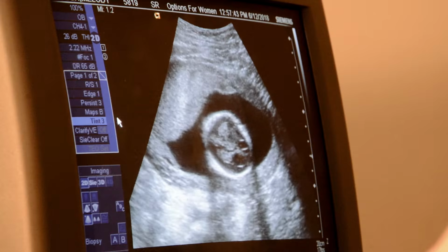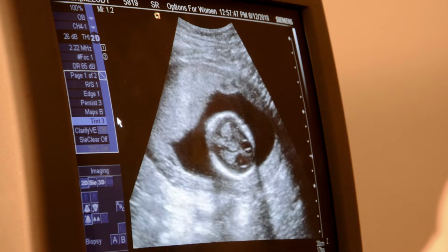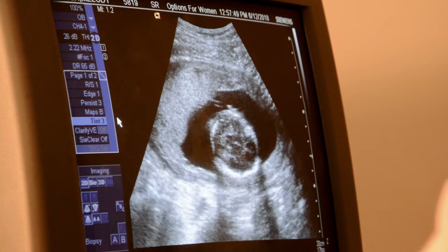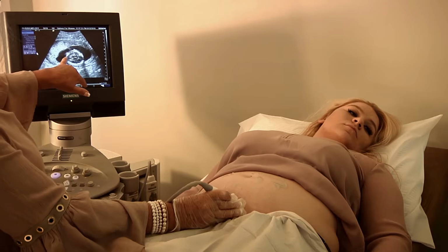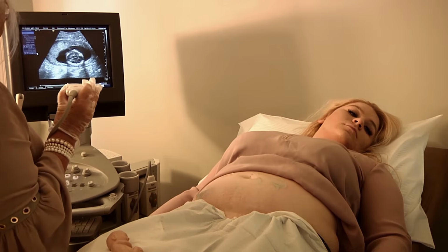And there's our head. Here we're up a little too high, right? Too much of a circle. Come down just a tad. And there's your thalamus, your broken falx. And then you measure from outer to inner.